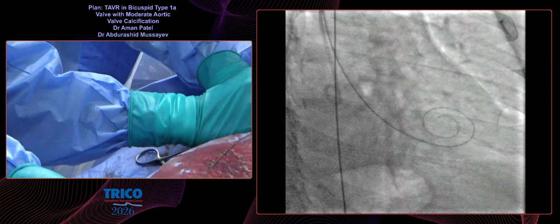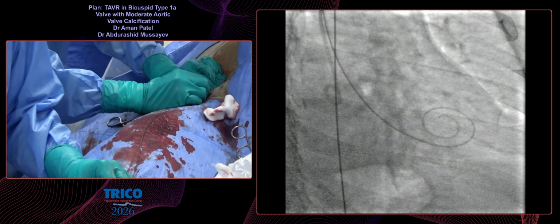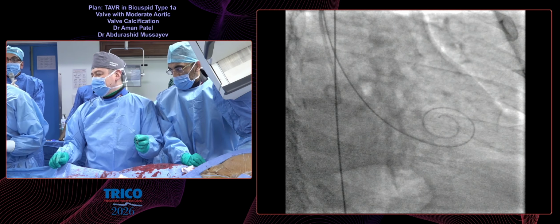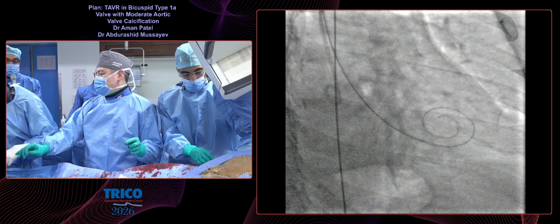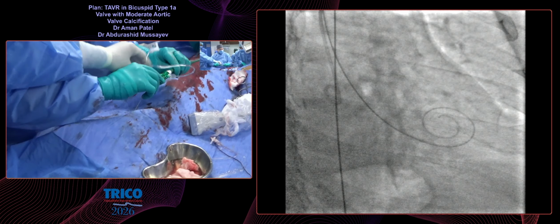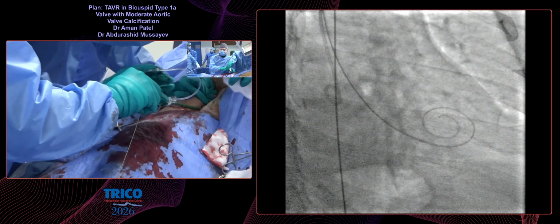That's a very thoughtful plan because, as you said, the valve is going to be anchored at the bicuspid fusion and not at the true annulus, and the baseline EKGs. That's really good thinking there. We routinely use a transvenous pacemaker, but generally we have a more aged population with some underlying conduction abnormality. But this is very good learning for me.